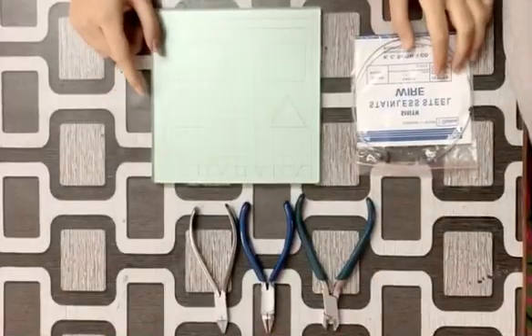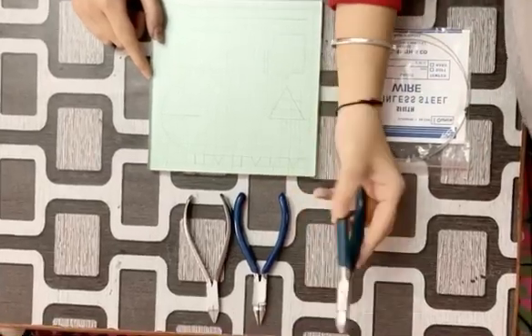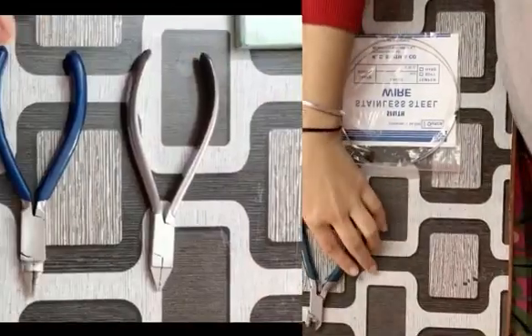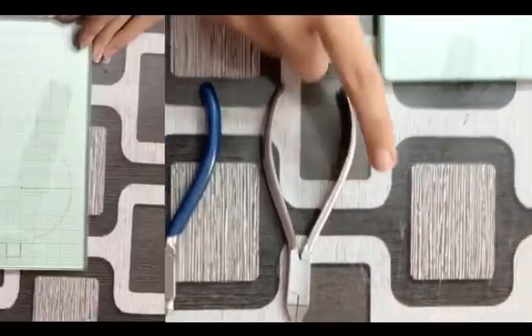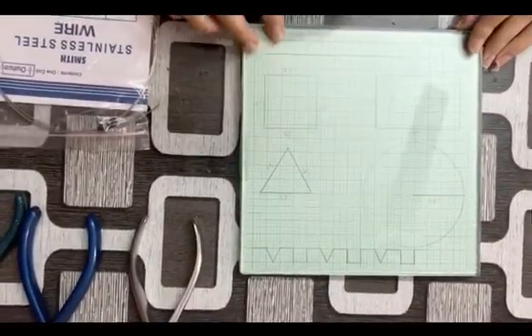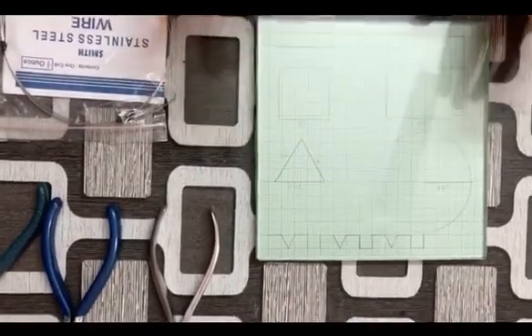Here is the armamentarium: this is the cutter, this is the universal plier, and this is the adam's plier. I also have a glass slab on which I have drawn various shapes — neglect that, it's just for practice.